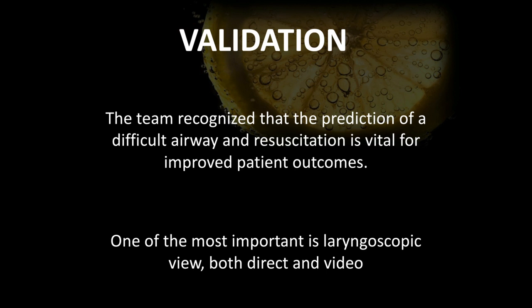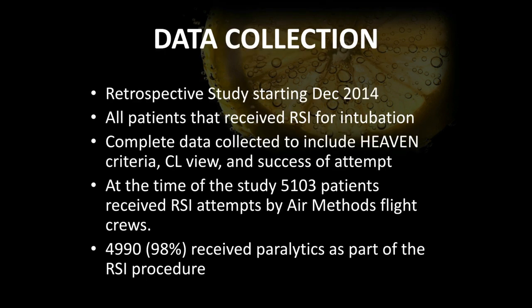And vice versa. You determine, hey, I am identifying a hypoxic patient. They're not maintaining SpO2s like I'd like, even though we're really oxygenating them with passive oxygenation. I feel probably more comfortable with this patient to use a DL approach. I'm going to go direct, and you get in there and you realize, hey, video is going to be better. You can simply move your eyes up to the camera, readjust your blade. So that's really the approach to the validation side, is understanding. It comes down to training on both direct and video applications.